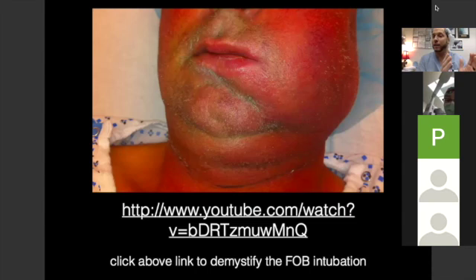But difficult to ventilate, now you're in the emergency pathway. So you try oral nasal trumpet, it's not working. You put LMA, it's not working. All of a sudden, you're in the invasive airway part of your algorithm, which means you have to do surgical airway, jet ventilation, and potential surgical airway. So we want to avoid that by not going to sleep. Keep this gentleman spontaneously breathing. Once the tube is in and secured, then go to sleep.